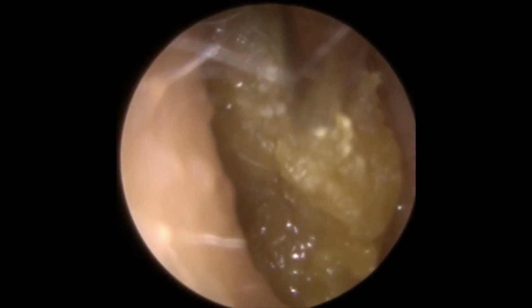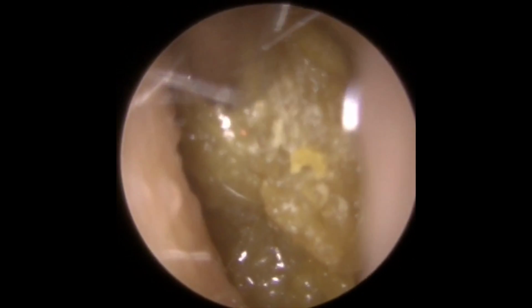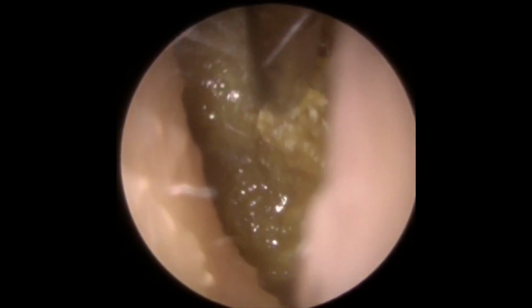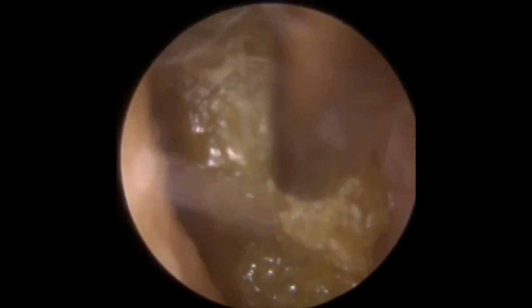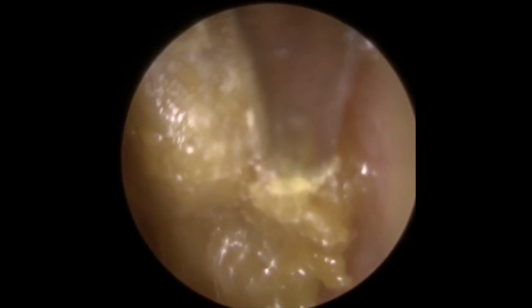You can see now, I told you to go away and make yourself a cuppa, because this takes forever to get. And this is just one side. Luckily, there was hardly anything in the other side. But the canal on the other side was that little bit wider, so a little bit more open. Now, as we've pulled down from the top, we can see a little bit of dead skin. This means to me that we're getting closer to the end of this block of wax.